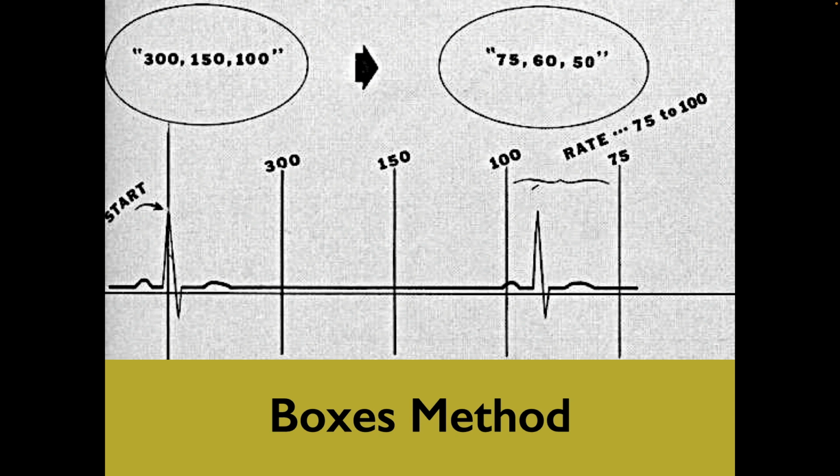And then you look at it and you say, is it closer to the 100 or closer to 75? So what do we think? Closer to the 100 line or the 75 line? 100. So I would say about 85 or 90, and that kind of approximation is good enough. So the rate here is 85 or 90.